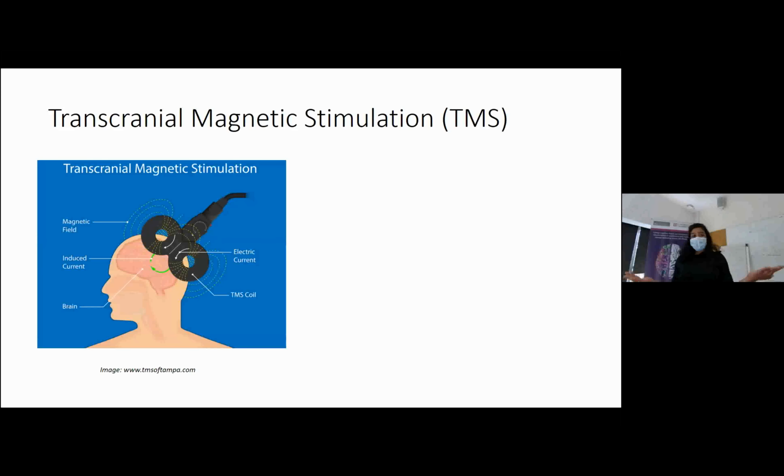We all, I think, understand to some extent how TMS works. It involves a coil that we place on the scalp, and the coil is basically a current carrying conductor. The direction of current in the coil changes very rapidly, meaning the magnetic field associated with the coil changes, which means that there is induction of secondary currents in the underlying brain region. Which translates to a change in potential across membranes, basically. TMS has been shown to be quite focal in terms of what regions you're targeting.